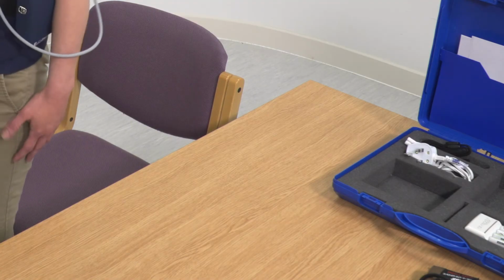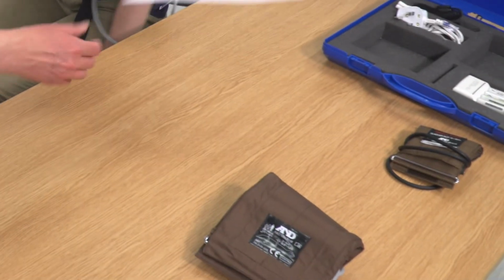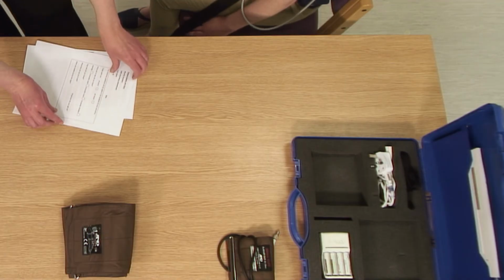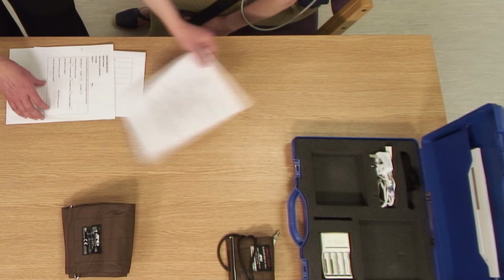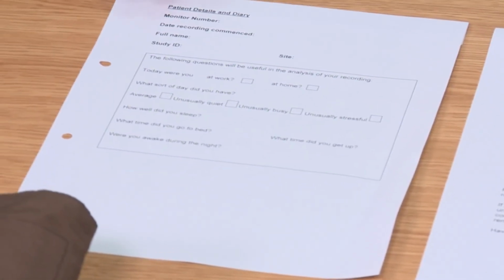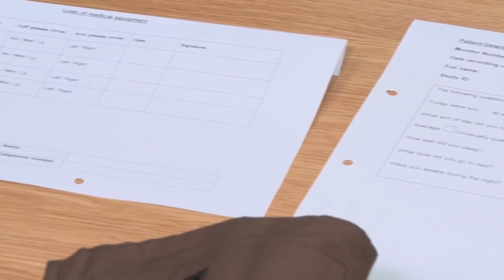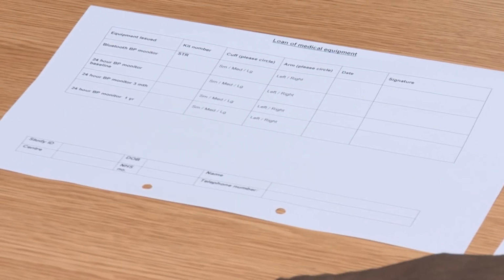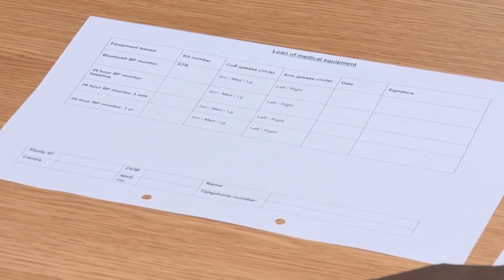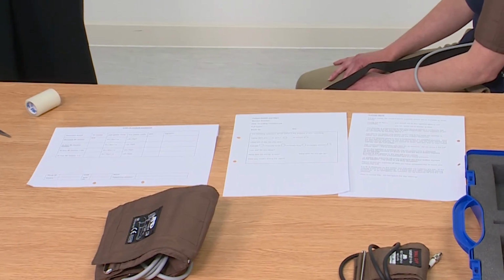Ensure the patient has the instruction sheet, which advises against vigorous sport, using machinery or heavy physical work. Ensure the patient knows to complete the patient diary, especially sleep and awake times, and consider arrangements for the equipment being collected or returned. The monitor must not get wet, so bathing or showering should be avoided until the equipment is removed.